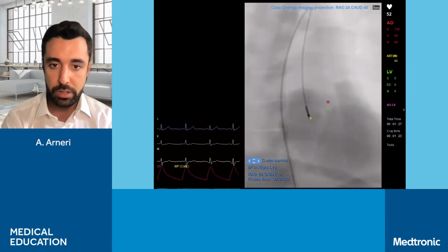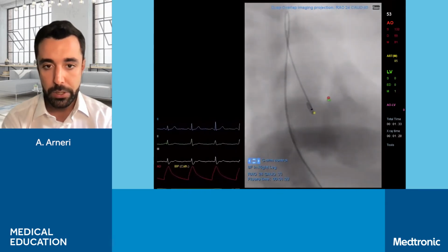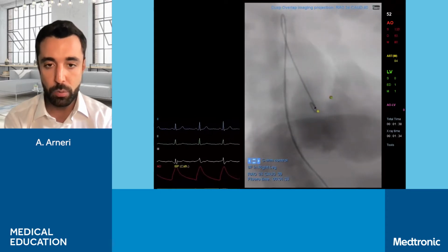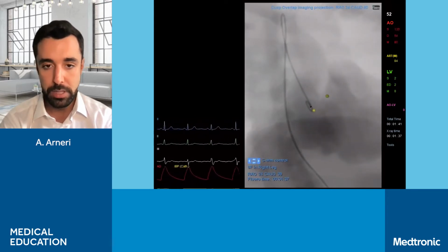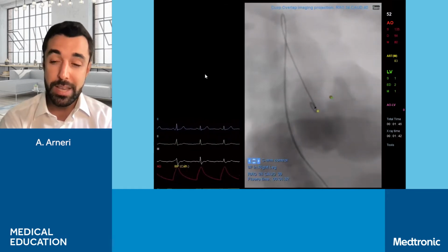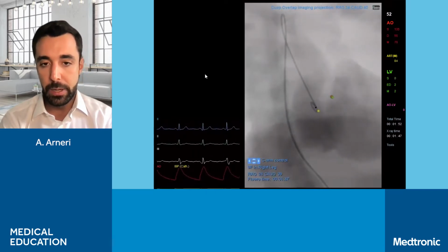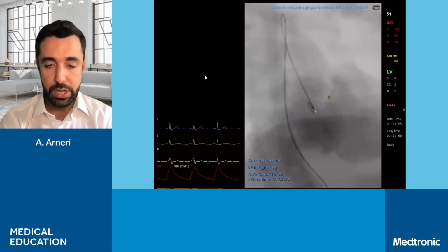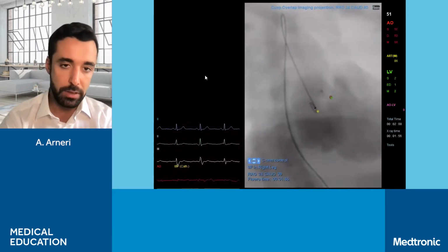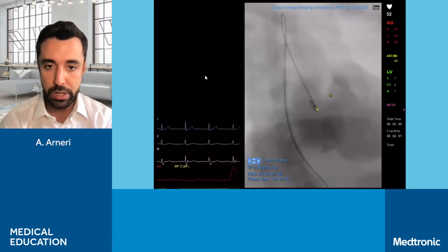So we can go in that projection. It's called cusp overlap view because we are overlapping 2 cusps one onto the other. As you see, we are overlapping the green dot with the red dot, so we are overlapping the right and the left cusp. This is a more recent view that we are using because, compared to the old one, this is helping us to really see the real implant depth of our prosthesis, and also has other advantages like better seeing the length of the ventricle, not having the spine over the screen and so on. So the first projection is the one that we're going to use to implant our prosthesis.